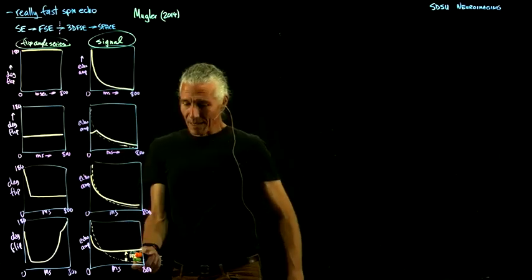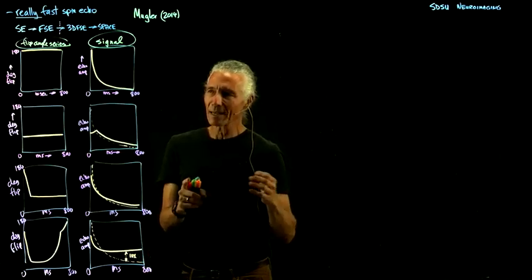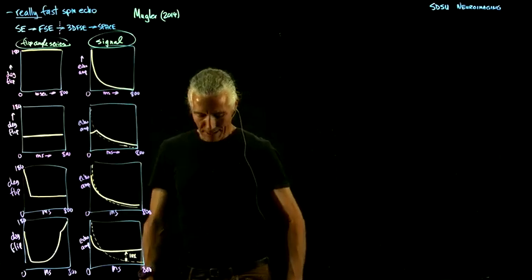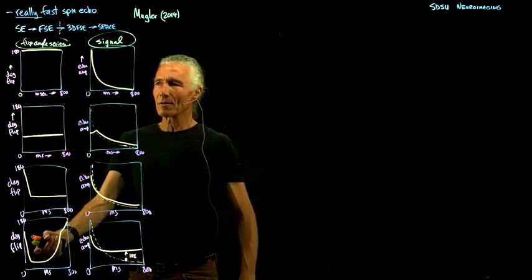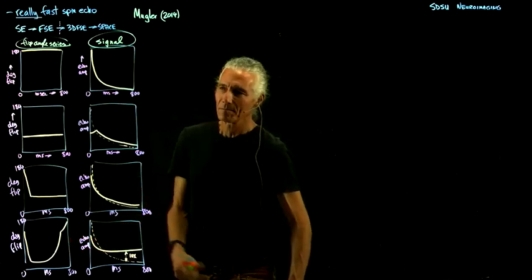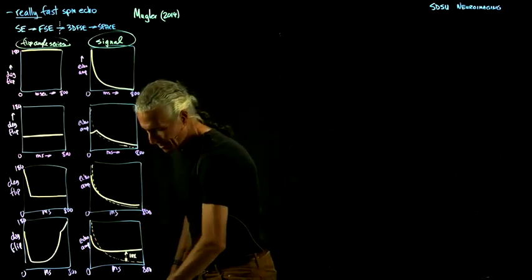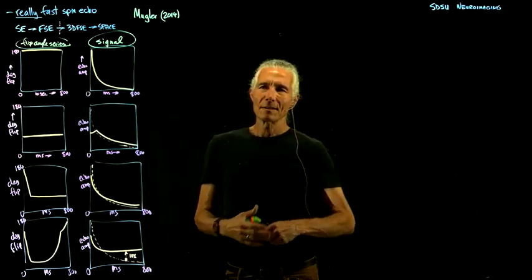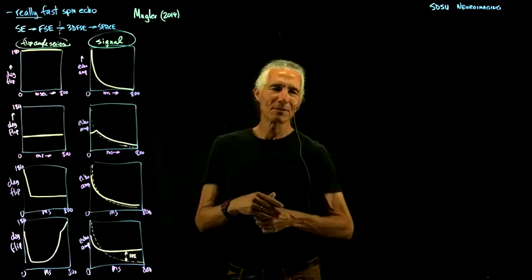So you basically would have gone down to virtually nothing, but at 800 milliseconds, that's a full second later, you've actually got a decent signal to work with. And on top of that, you're really cutting down your high energy deposition, except at the very end there. So this sequence, surprisingly, was originally developed for imaging the abdomen. I don't know why, they just didn't suggest using it in the brain.